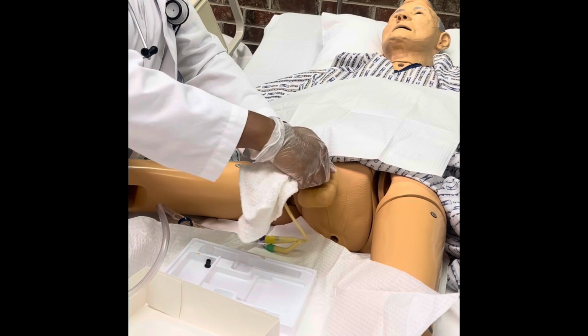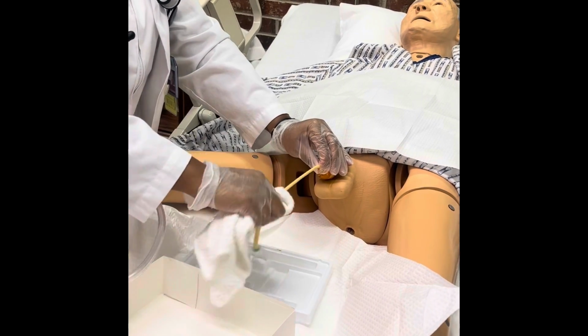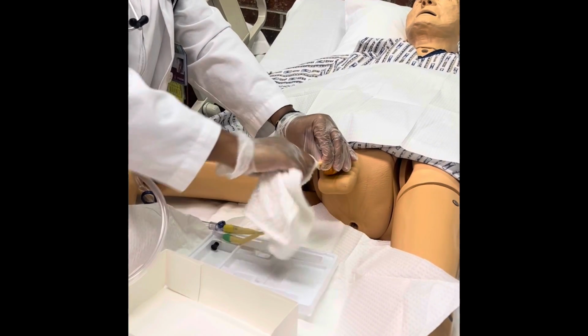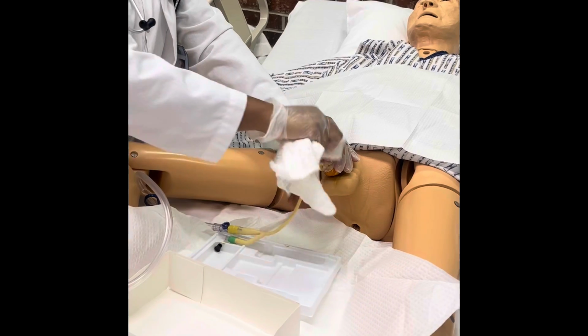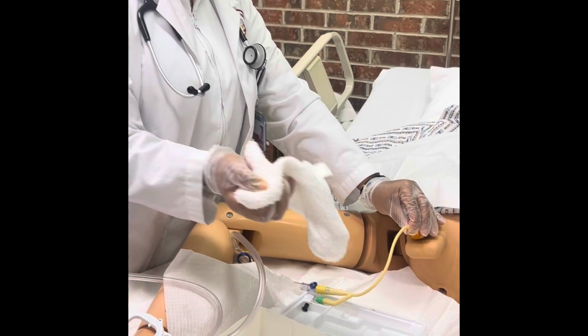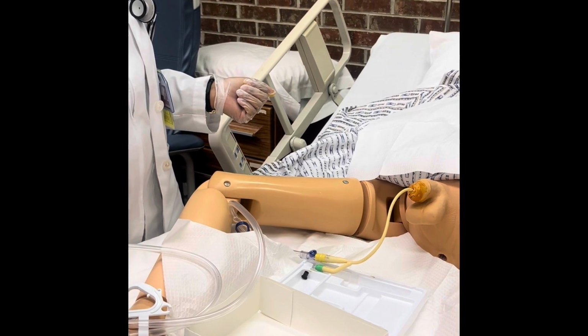And I'm gonna start at the very tip of the penis as much as I can and go down it in a circular motion. And do that a couple times. If the peri wipe got too dirty or too messy and I feel like I need to get another one, I would, and keep doing this till I feel it is clean. All right, now I'm gonna discontinue.